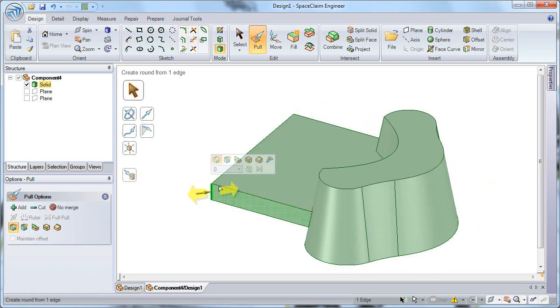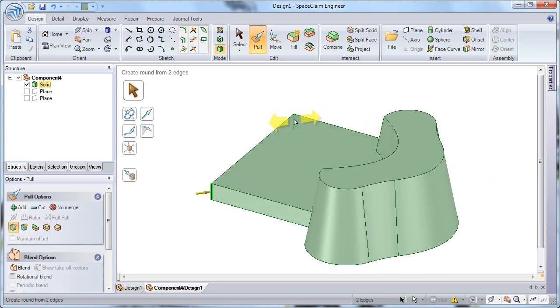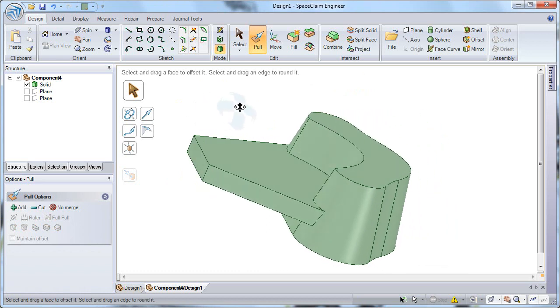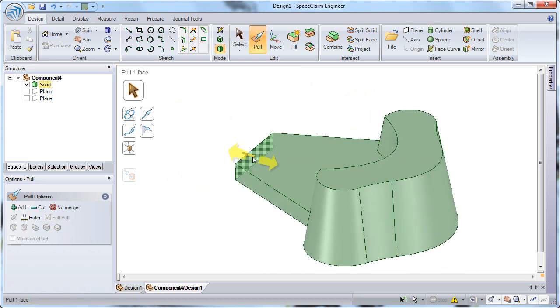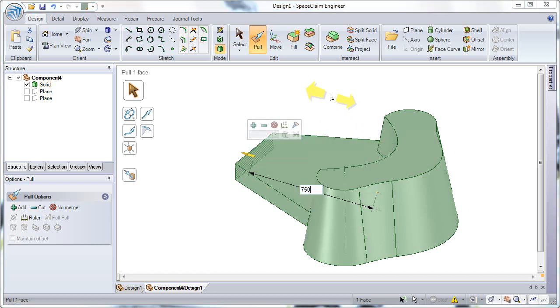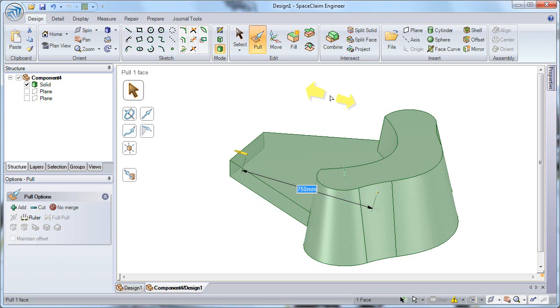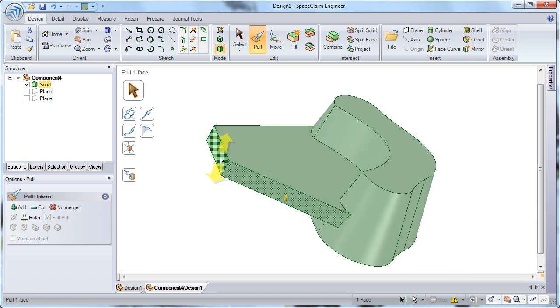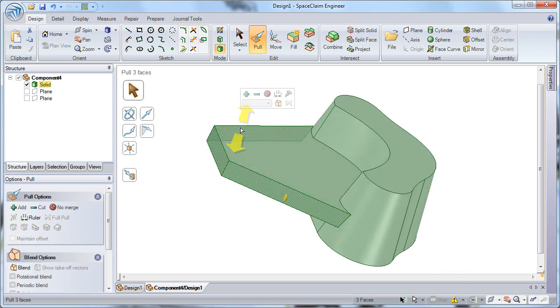Now if I select on the two edges on the back of my base and choose the pivot edge option from my tool guide, I can pivot those edges inward to angle the geometry of that base. And again, if I want to specify strict dimensions, I can do that at any time by selecting on the back face, choosing the ruler dimension that pops up from my mini tool guide, and choosing a reference to dimension off of. So I can expand that base out to 750 millimeters. And finally, to complete the design of the base, I'd like to select all three of the vertical faces on the back of that base, and right-click and choose to create a full round.